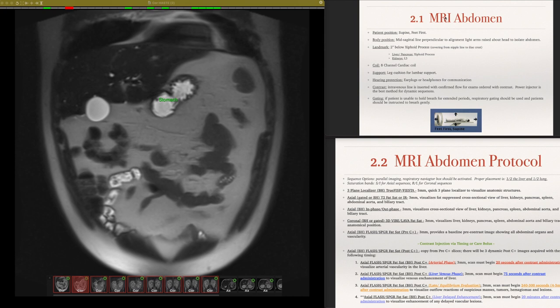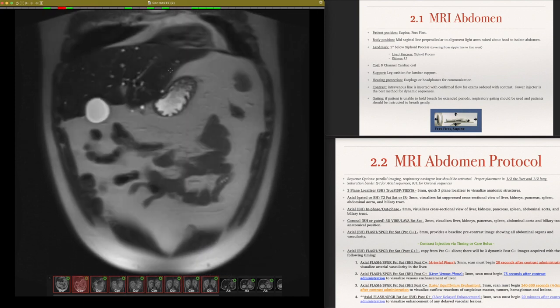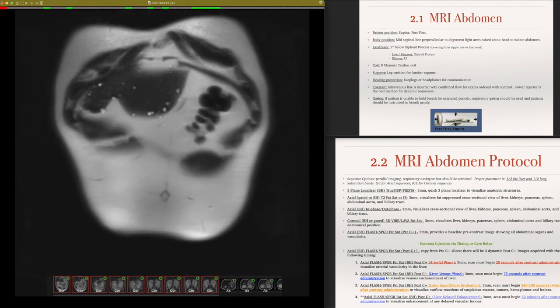All right, let's jump into the images to the left here. We're going to be looking at the HASTE sequence. It shows a nice color differentiation, tissue characterization between water, fat, and just solid organ tissue. We'll start with the coronal view. As you can see, we're on the anterior aspect, and we'll come all the way through. But again, to repeat, this patient has a history of polycystic kidney disease. Normally with polycystic kidney disease, you can likely get hepatic cysts as well, and in some cases pancreatic cysts as well. So we'll be checking those out too.